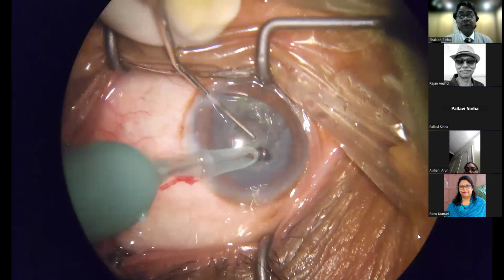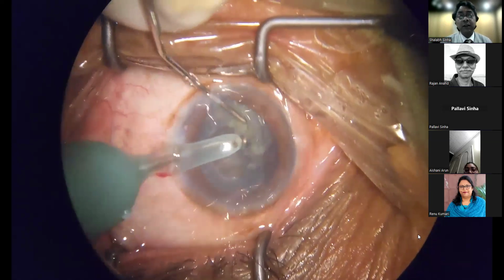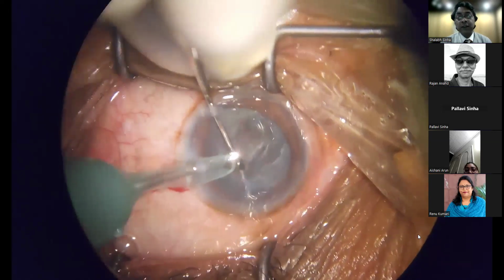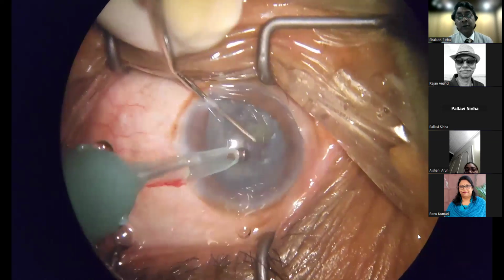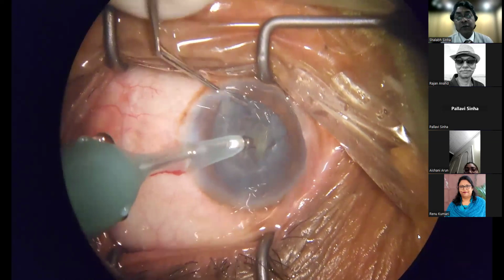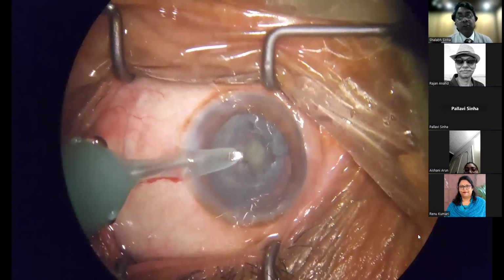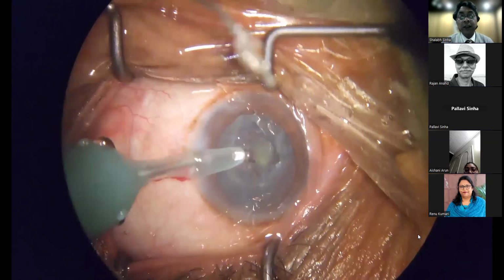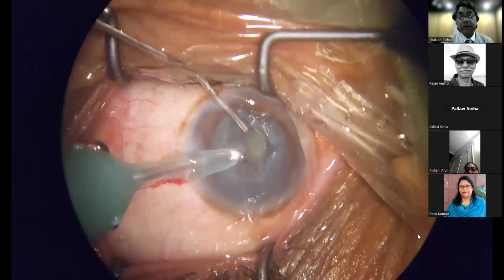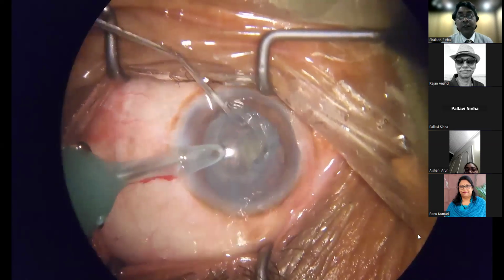Again, trying to hold one edge of the heminucleus, but I'm still not successful in bringing it up. So small fragments are coming, but not the entire heminucleus. Some viscoelastic going inside the eye.